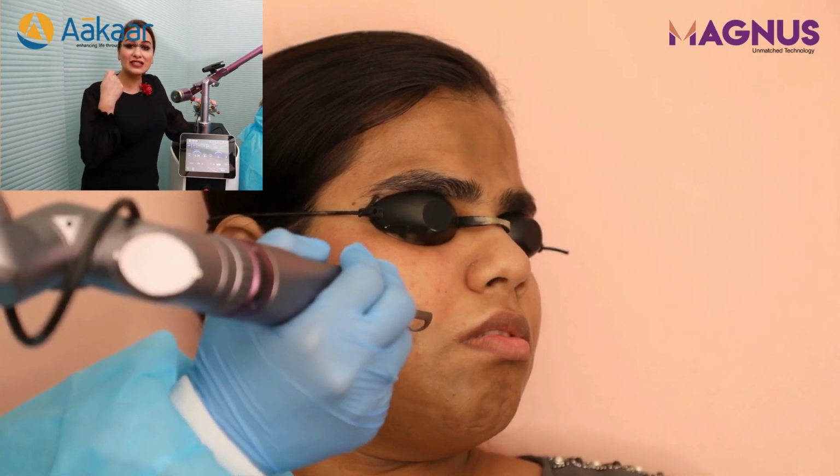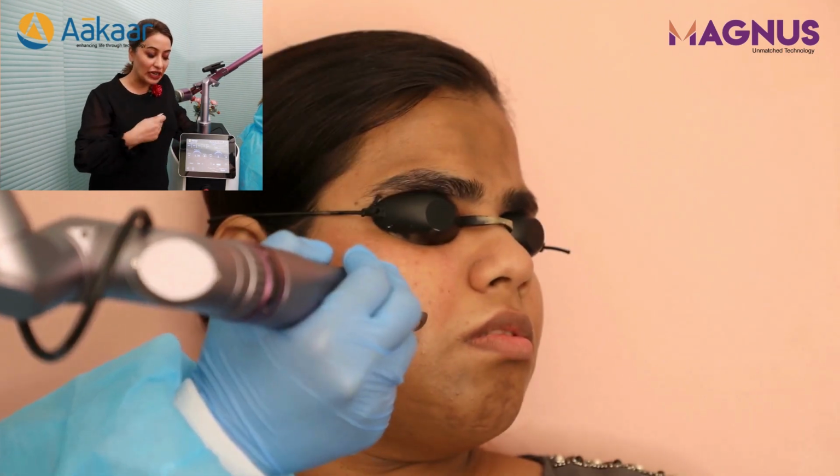And remember that Q-switch is something which will take your cosmetic practice to the next level from day one. Because what does a patient want? A patient wants a face which is free from hair, free from blemishes, with the open pores reduced, and that is exactly what you are seeing here on the screen. This is what this laser can deliver.